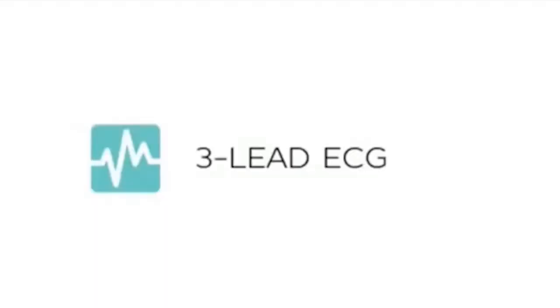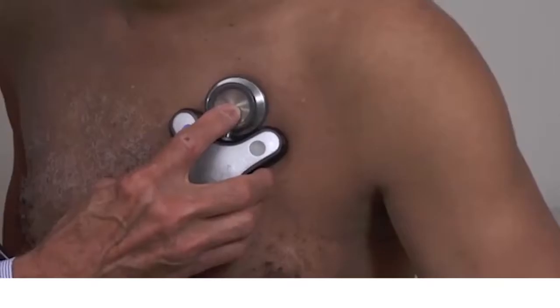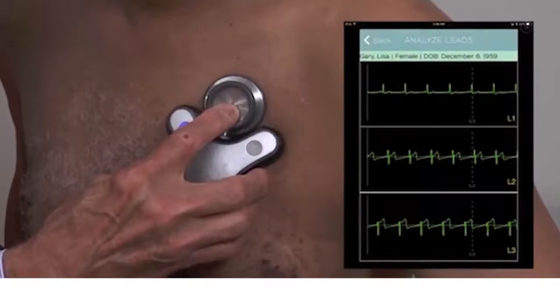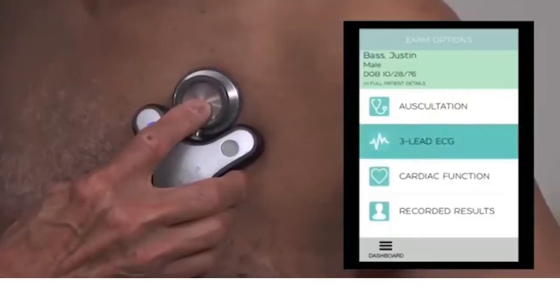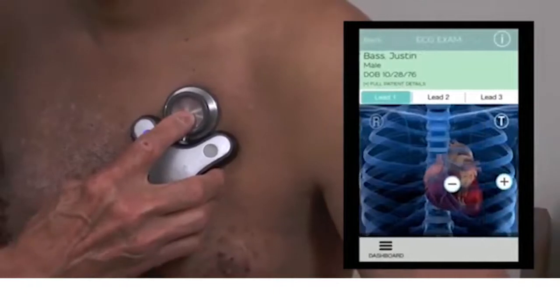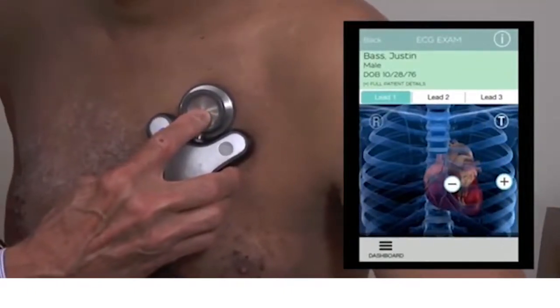Three-lead ECG: Cardio Sleeve dry ECG electrodes record high-fidelity ECG at leads 1, 2, and 3. To begin, a chest illustration displays the proper Cardio Sleeve placement for a specific lead recording.